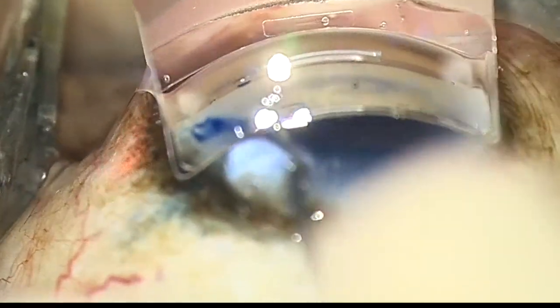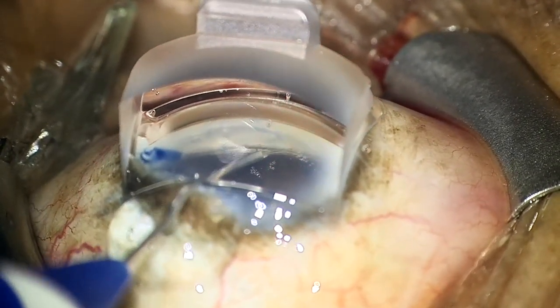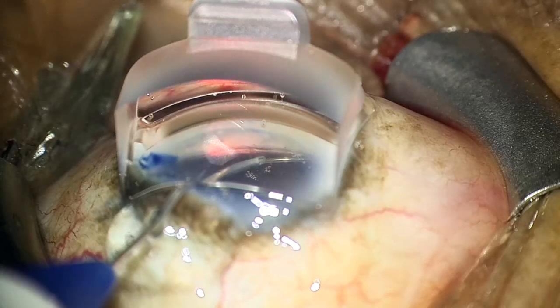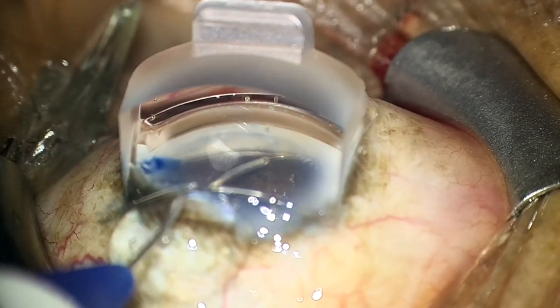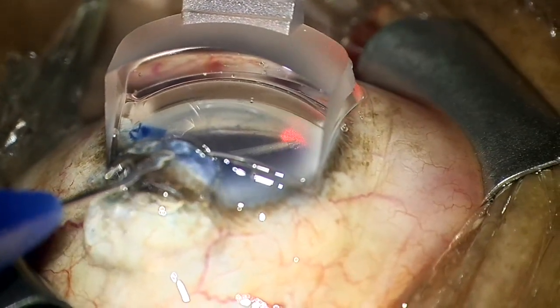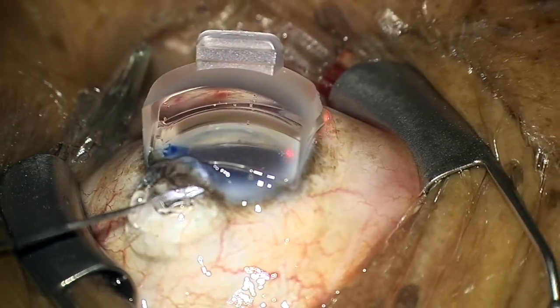After trying to click the visco-injector a few times, the catheter still cannot be advanced, so it is retracted back into the injector and the injector is removed from the eye. I switched places with my trainee and gave it a try myself, and this time the catheter went 360 degrees around Schlemm's. Since a pressurized viscocanaloplasty had already been performed for the first 270 degrees, no additional viscoelastic was injected as the catheter came around the second time. But in order to perform the canaloplasty for those final three clock hours, the catheter was retracted, visco was injected, and the catheter was pushed forward again. Using a technique described by Arsham Shabani, the injector was pivoted forward by about 90 degrees to get better purchase of the catheter in the canal before the handpiece and catheter are pulled out of the paracentesis to perform as large a goniotomy as possible without having to retrieve the tip.